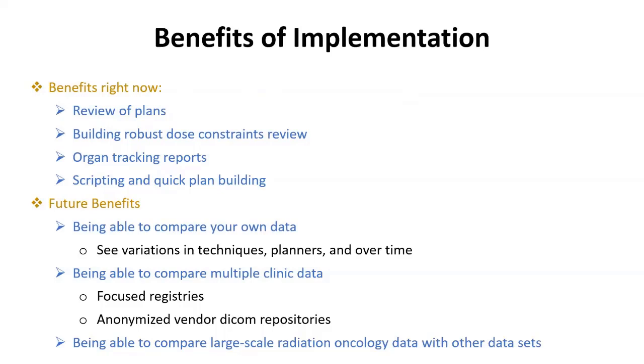Scripting and quick plan building. This will make it easy for the programming to grab the information and do the auto planning, DVH analysis, and much, much more. For the future benefits, being able to compare your own data. You could also participate in studies like protocols, studies, trials, and so on. It will be easy for you because you have a standard. So you are here, let's say in Saudi Arabia, meeting people who are dealing with the same terminology in the United States, in Canada, in Germany, and so on.